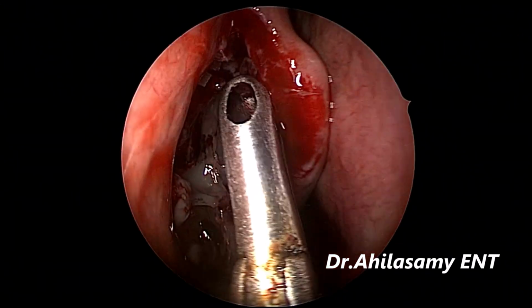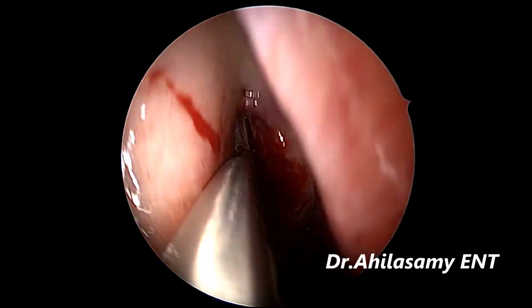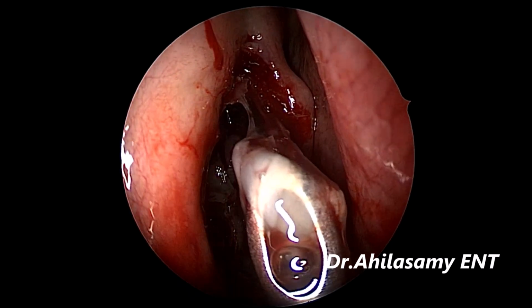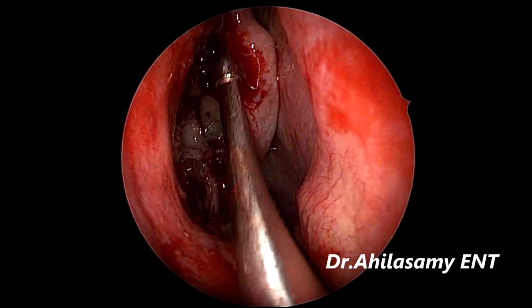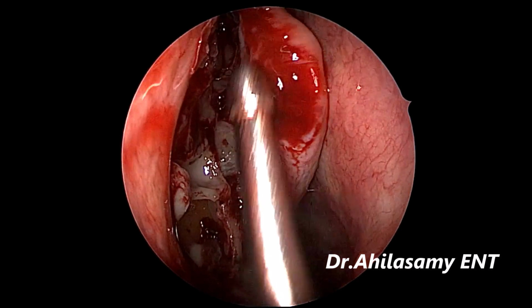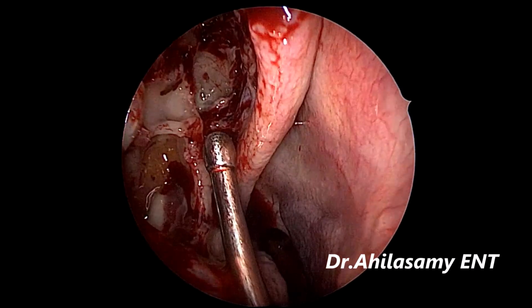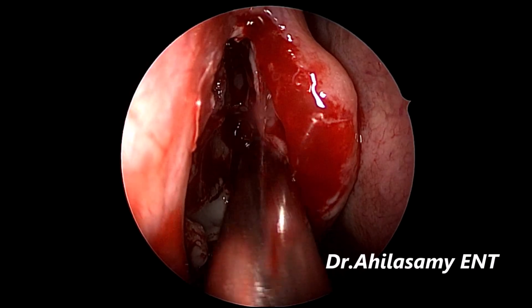And don't strip mucosa, use through-cut instruments or a shaver throughout the surgery. Don't pull the mucosa. Here I am taking out the agger nasi cell with the 0-degree telescope itself. Later I will change to a 70-degree telescope. So the curved sucker is introduced into the frontal recess. Do not destabilize the middle turbinate, which is very important. See how I am maintaining the middle turbinate close to the septum.